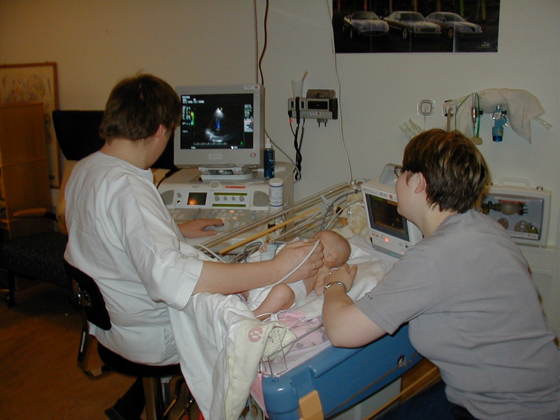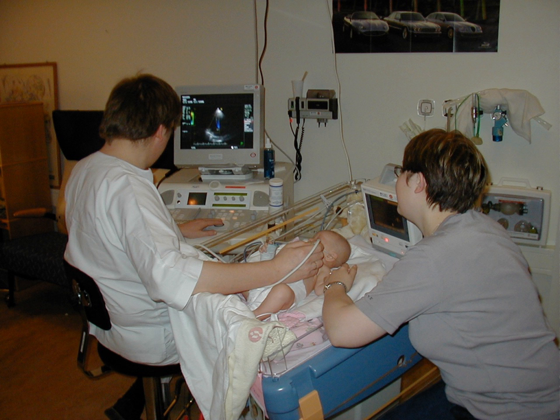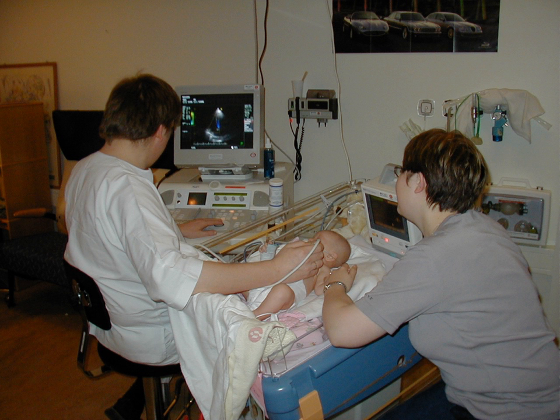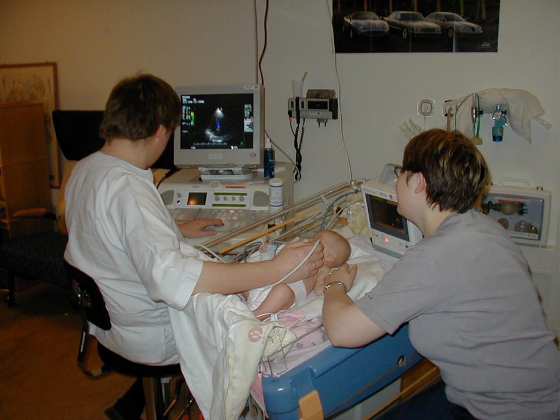Ultrasonography is widely used in medicine. It is possible to perform both diagnosis and therapeutic procedures, using ultrasound to guide interventional procedures such as biopsies or drainage of fluid collections. Sonographers are medical professionals who perform scans traditionally interpreted by radiologists or by cardiologists in the case of cardiac ultrasonography. Increasingly, clinicians and other healthcare professionals providing direct patient care are using point-of-care ultrasound in office and hospital practice.